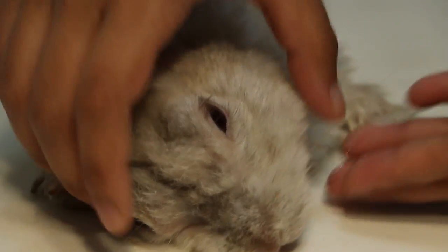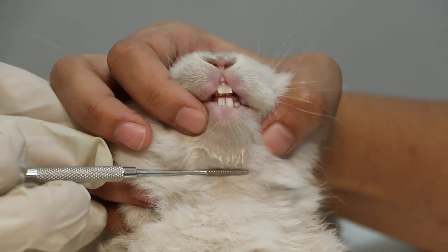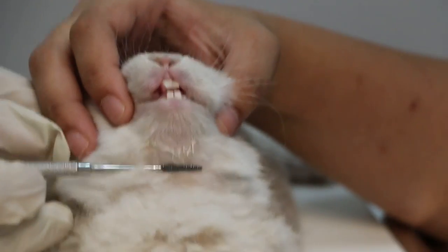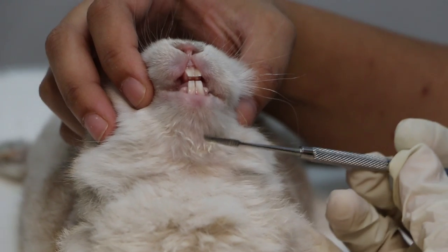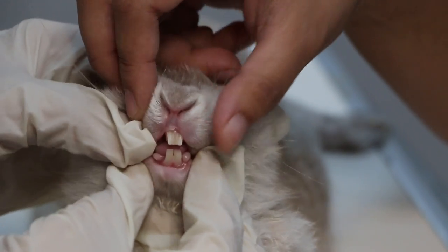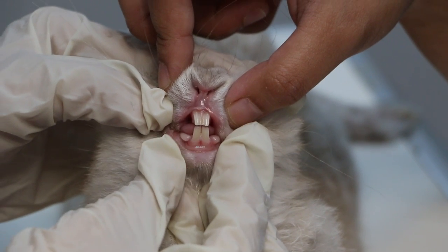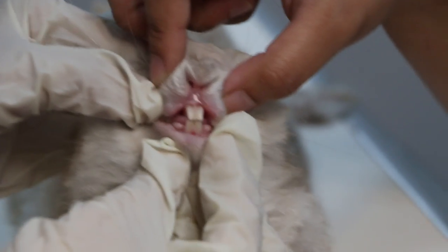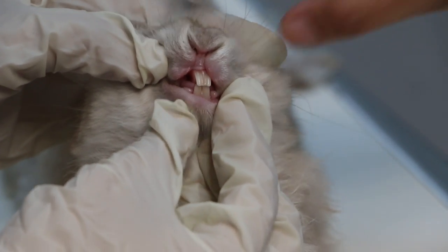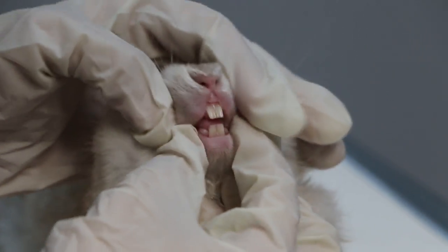Now we show the normal rabbit for comparison — there is no jaw abscess, no swelling on the left or right side. The front teeth are even, there are no molar spurs or sharp ends, and the teeth are not overgrown. The upper front teeth are slightly in front of the lower teeth — this is a correct, normal bite.